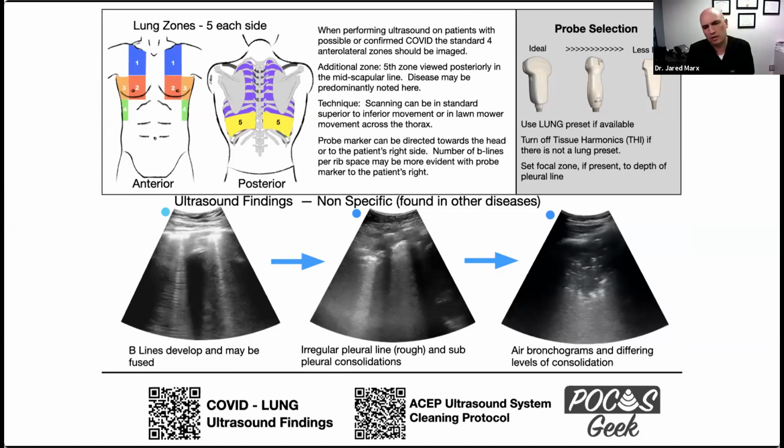In addition to this, because it was not known at that time how infectious this would be and how much cleaning would be required, we started working on getting a handheld ultrasound device so that we were not having our large ultrasound units being monopolized or shut in rooms for long periods of time or running out of wipes to clean these.